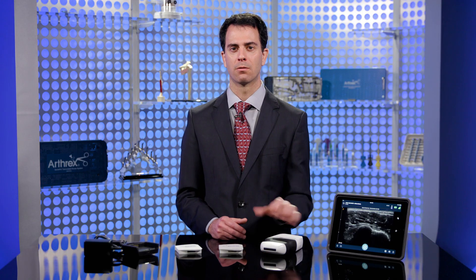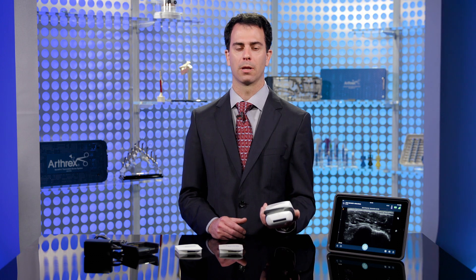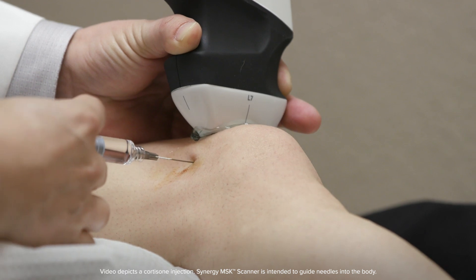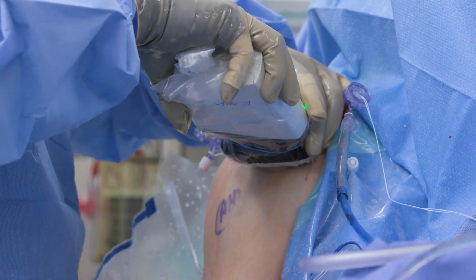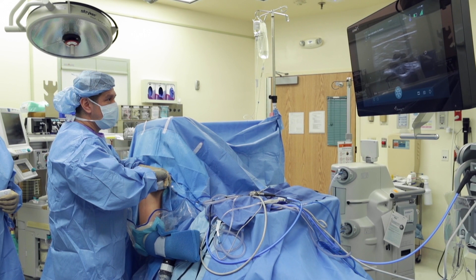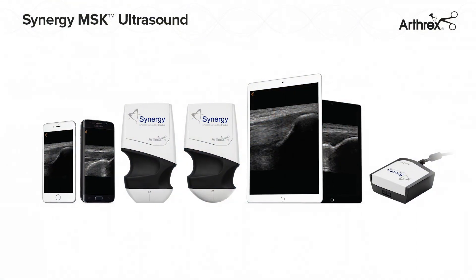The Synergy MSK Ultrasound is versatile, small, and lightweight, providing the freedom of portability. Conduct quick dynamic examinations of patient anatomy and needle guidance under continued visualization. Easily drape for use in the OR to locate loose bodies, image superficial anatomy, and provide precise guidance of soft tissue reconstruction, or even diagnose a player on the sideline.